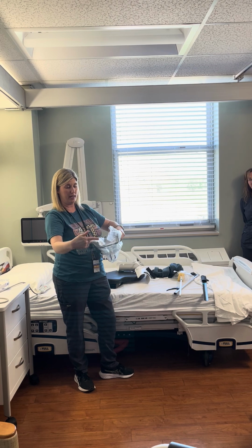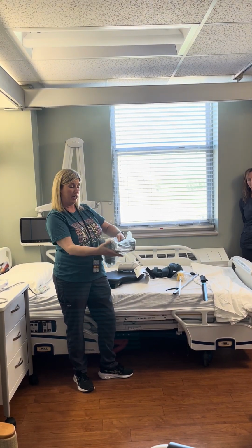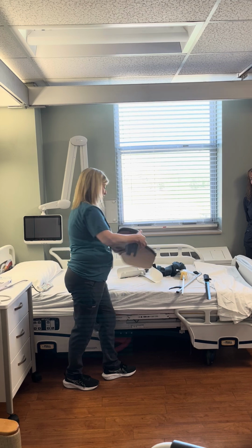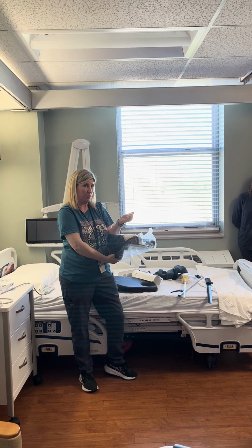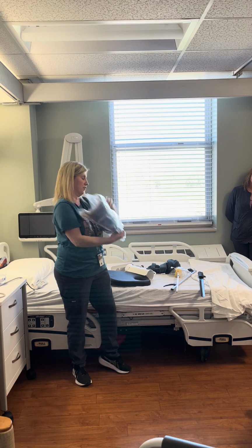There's a Velcro at the end that actually goes underneath to hold the pillow on there, and the other two straps are on top to hold their arm on there, okay? This is another type of tray. Sometimes someone who's gotten tight in their arm will start pushing up against this and it'll actually give them a sore or hurt them there.